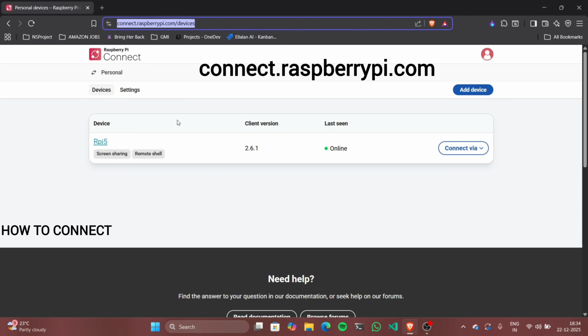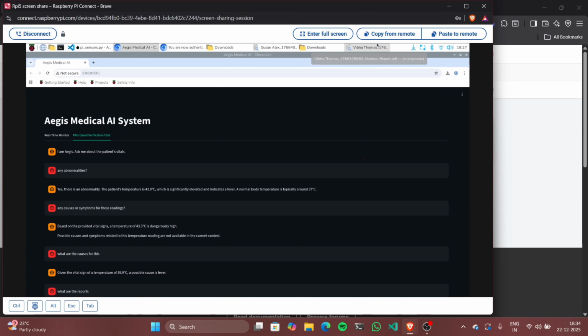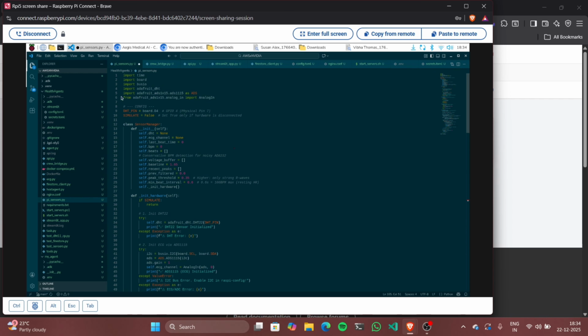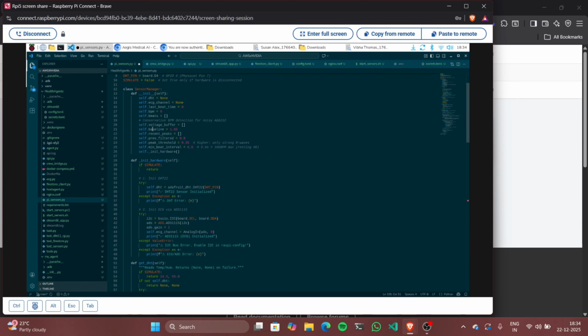So here we go to connect.raspberrypi.com, log in through your credentials, and there are two ways of connecting, that is screen sharing and SSH. Now waiting to connect, and finally here we can see the device, this is the terminal, and going to the code file, which is the Pi sensors, all the sensors that are connected.